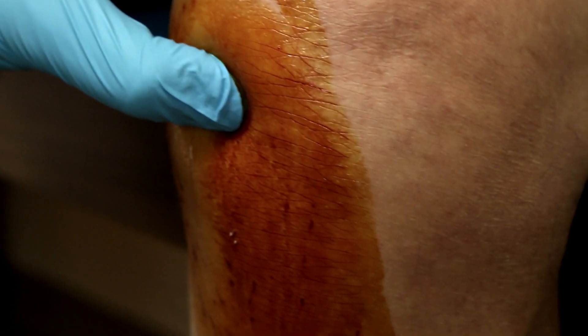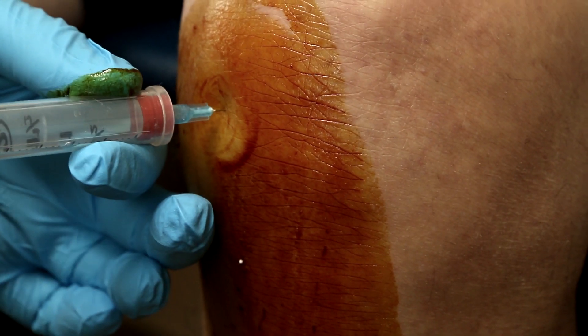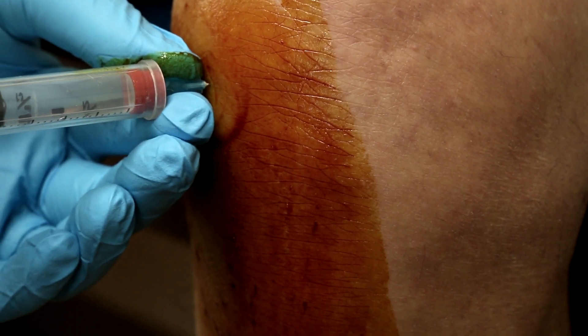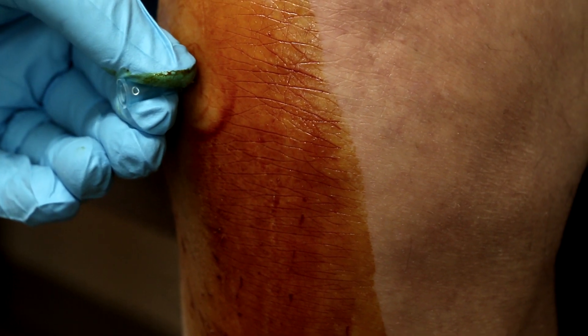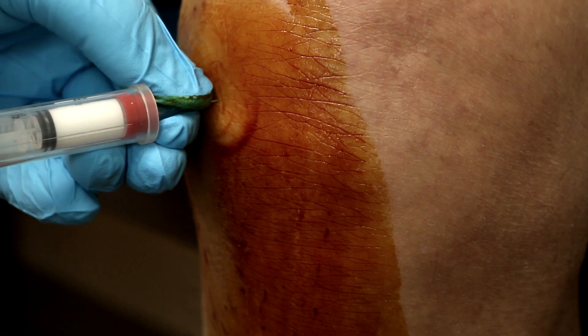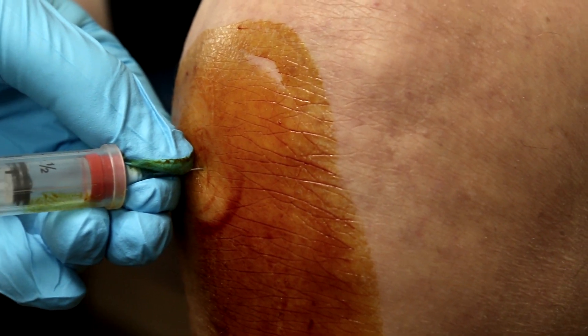I could barely feel it. That's my spot, and I'm going to give a shot right there. It goes oh so smoothly. How are you doing with this one? Okay. And then I put in the cortisone, and finish it off with lots of anesthetic — because anesthetic is good, and this is what's going to give us the immediate results.